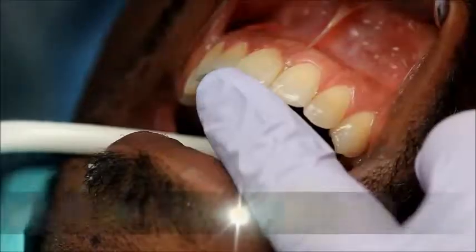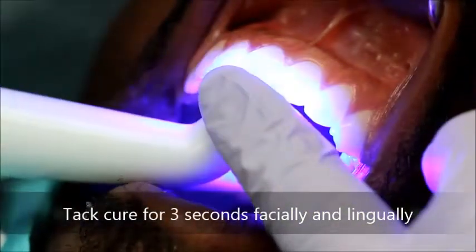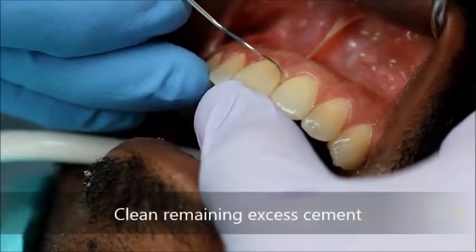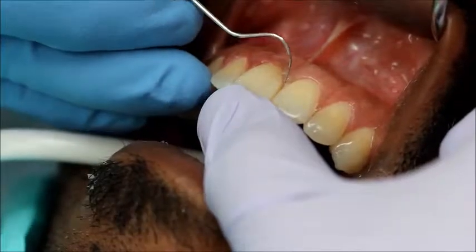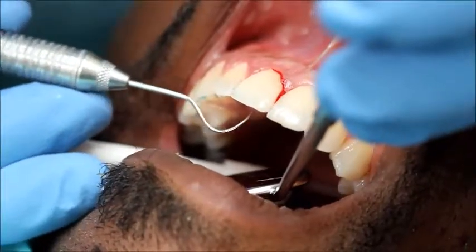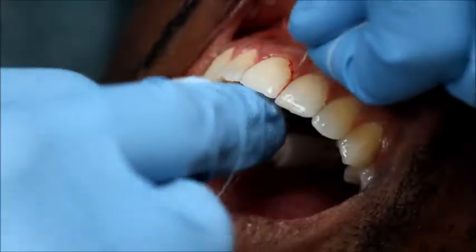The cement is tack cured for 3 seconds in order to more easily clean the cement. Excess cement is then cleaned with an explorer or scaler. Interproximal cement is removed with floss.